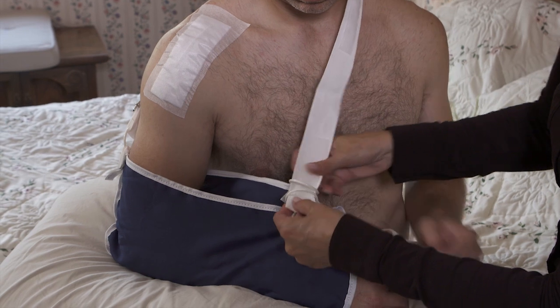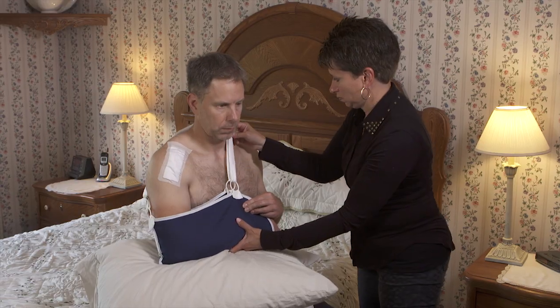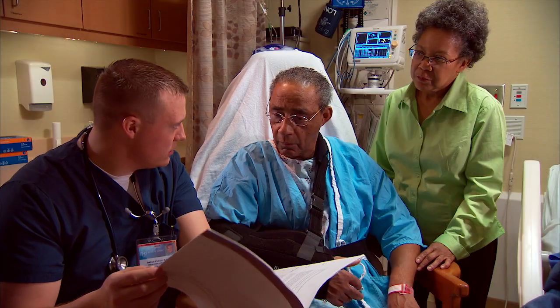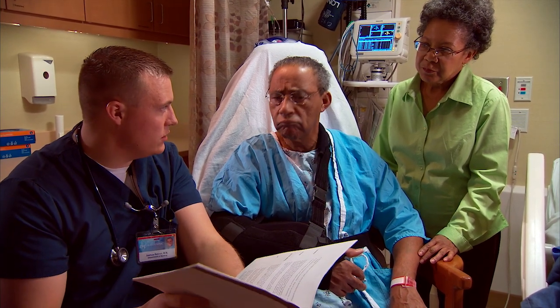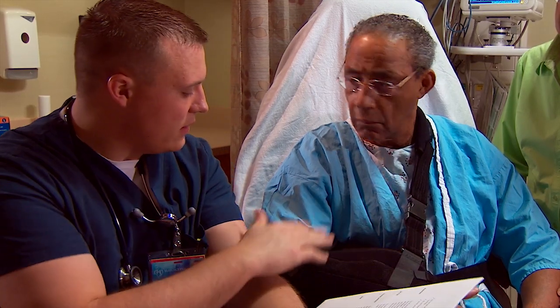Be sure your healthcare team has shown you and your caregiver how to do this. This helps you avoid movements that could damage your shoulder as it heals. Do not attempt to put the sling on or take it off by yourself unless your surgeon has given you permission to do so and a healthcare provider has instructed you in the proper technique.